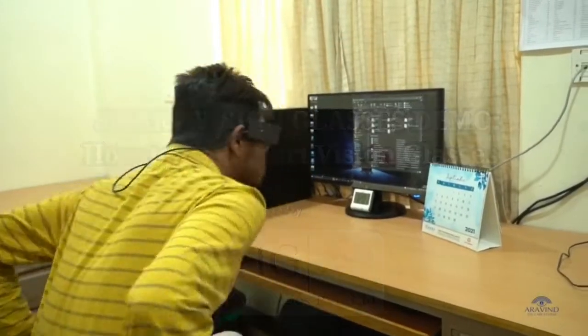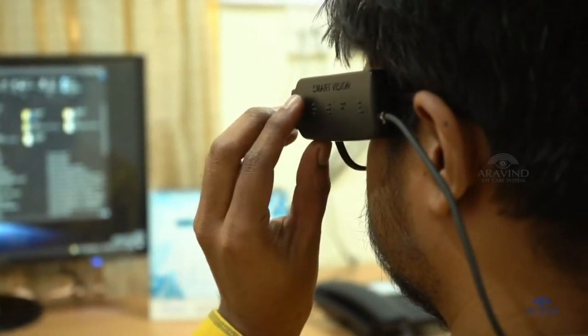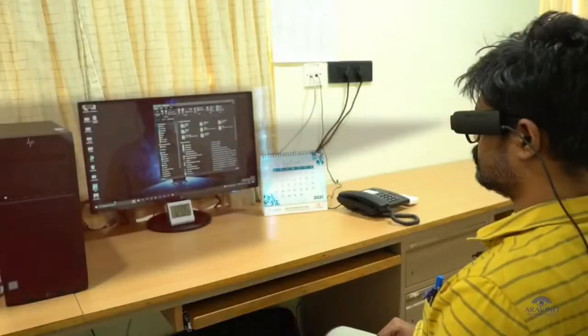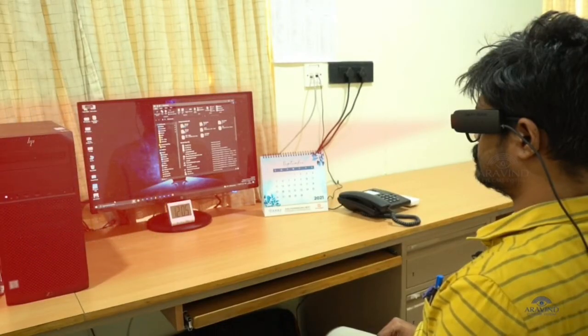How to use a smart vision glass? By pressing the first button, letter T in Braille, the camera focuses and captures things in front of the user. It also detects human faces in this mode. If a person comes into focus, they will be interpreted according to age and sex.